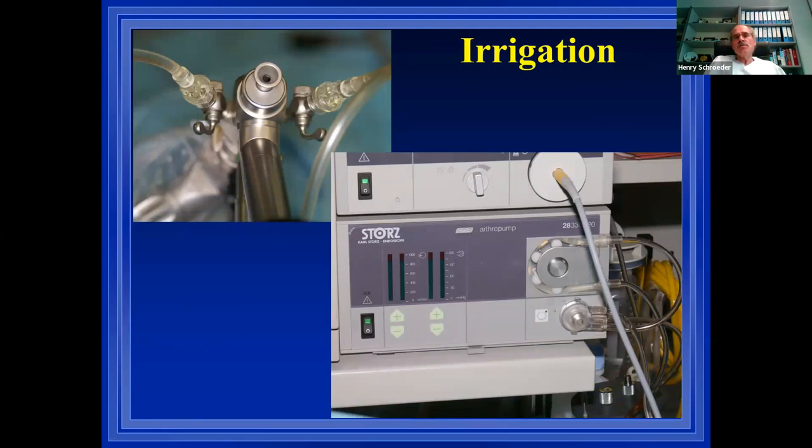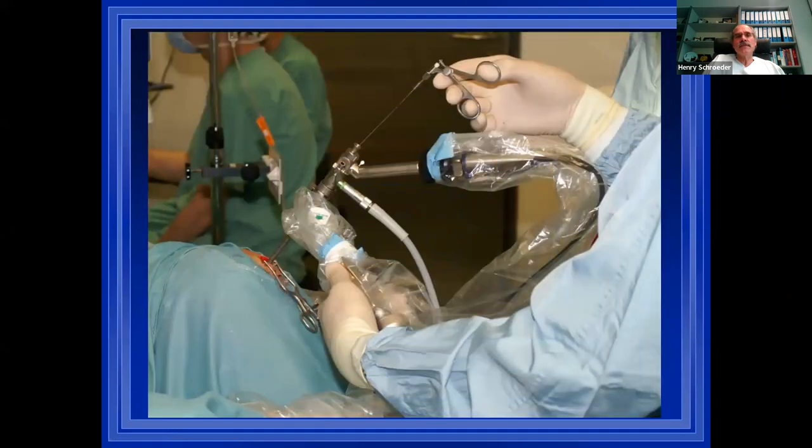Irrigation can also be done with an off-label use of the arthroscopy pump. The problem is the pump goes up to 200 millimeters of mercury or so, and has a high flow, as it's made for knee surgery. But if you are careful, place it at the right level and use a moderate pressure, you can also use it in tumor surgery when you have a prolonged irrigation. But most of the time we just use a syringe for irrigation.